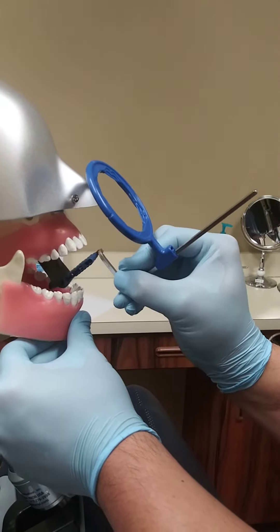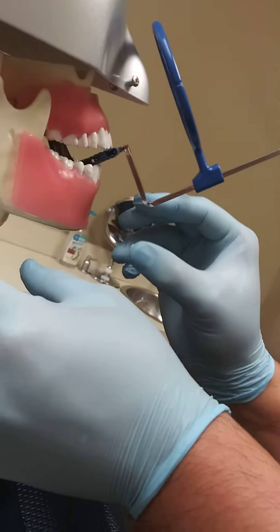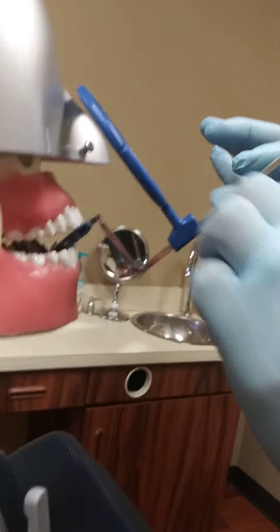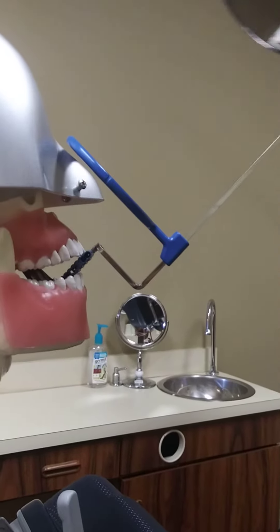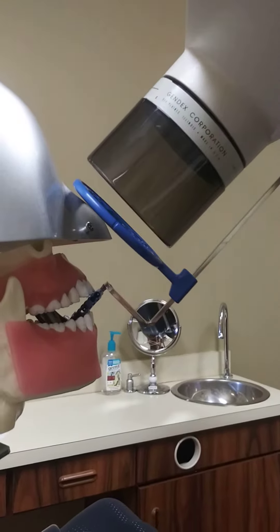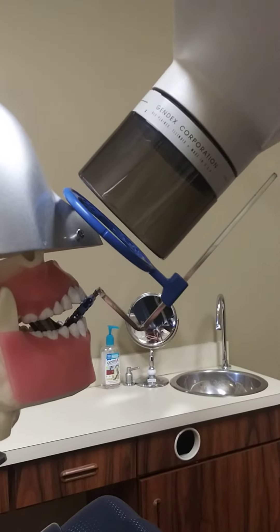Position it as far into the middle of the mouth as possible. Ask the patient to bite down. Then we would move the ring as close to the face as possible. Take our camera and line it up with the ring. And we are good.